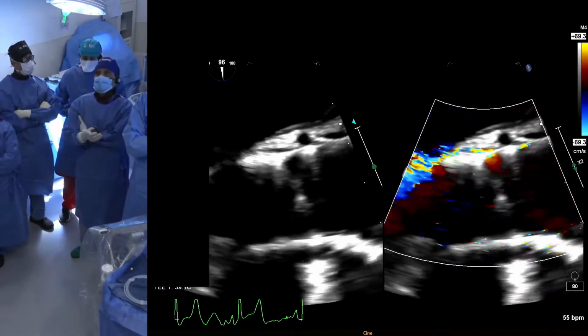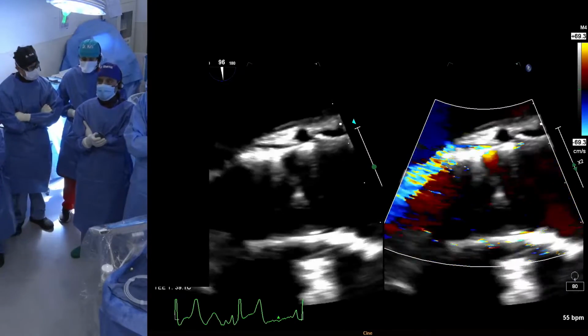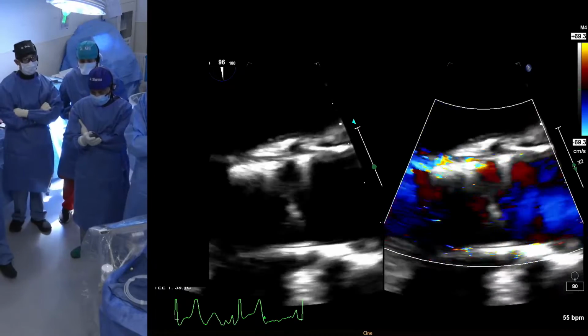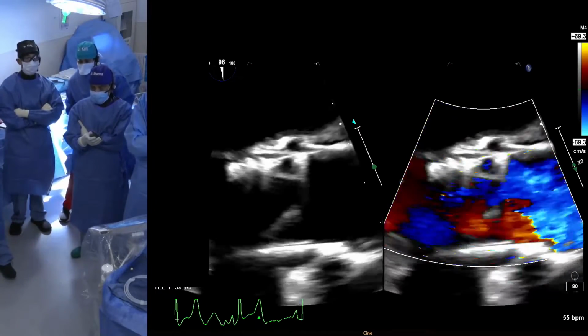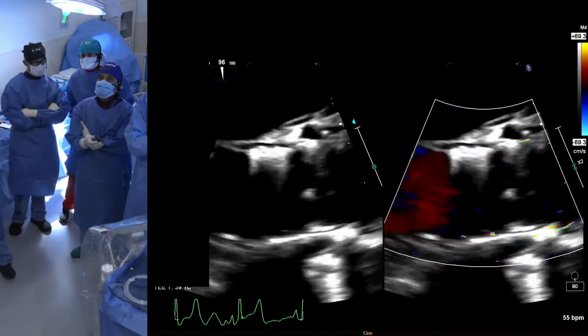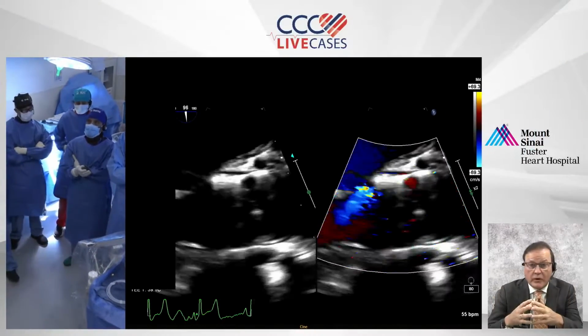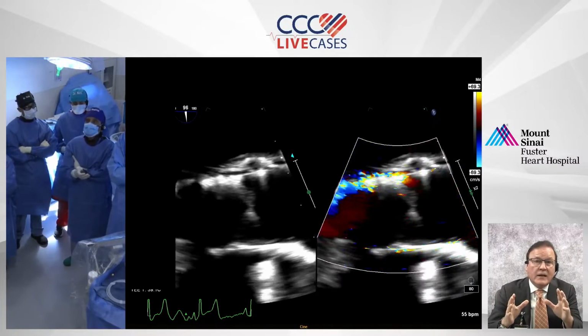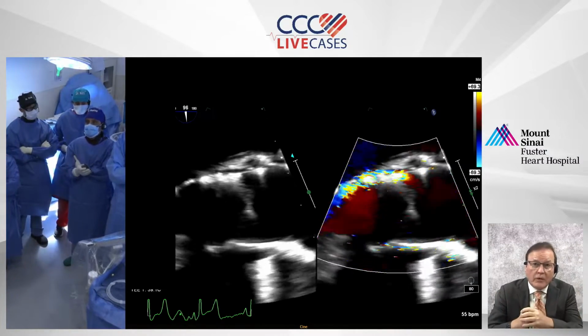At least these are highly selected patients, right? These are not real life patients, in terms of the real world. So again, we need to be circumspect about this. Yeah, if we call it, let's say, underexpanded, or let's say recoil, both of the two terms may be applied. What percentage would you balloon, and in which would you actually start by putting in a new valve?